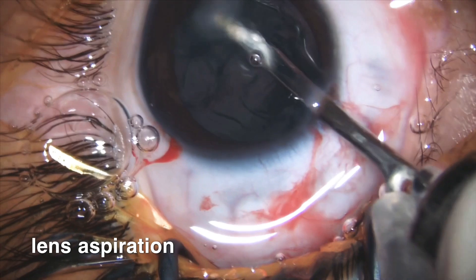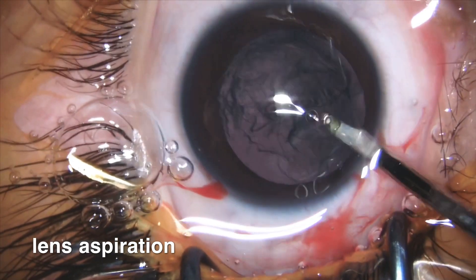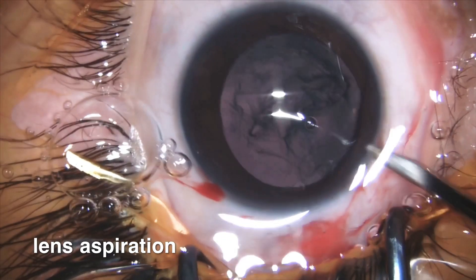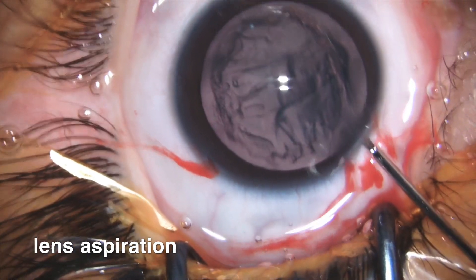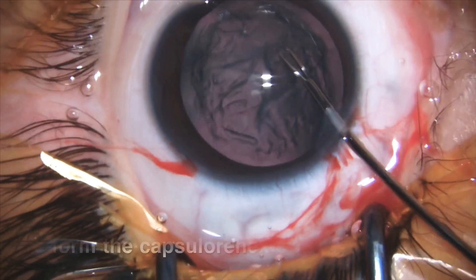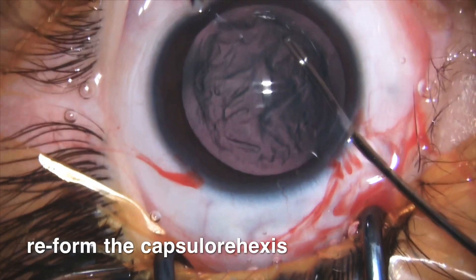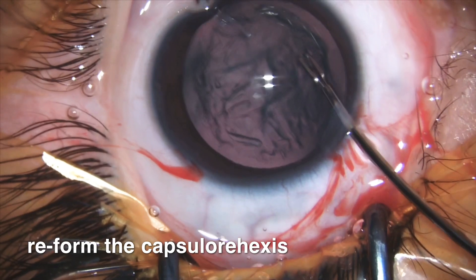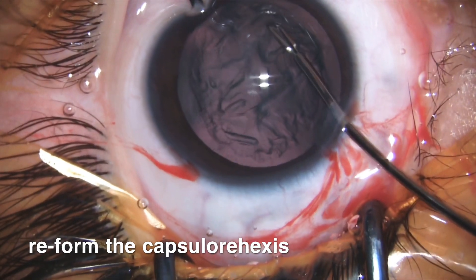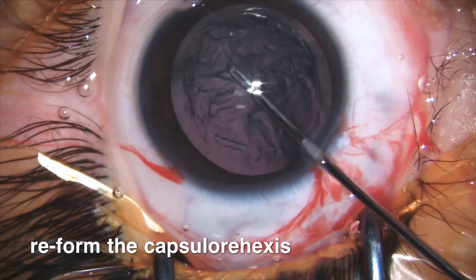Now with low flow rate I started to aspirate the exploded lens matter. There are a few critical factors intraoperatively while operating for a congenital cataract: the anterior and posterior capsulotomy.